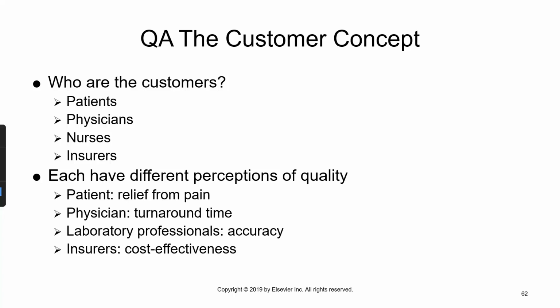Nurses. The nurses are the ones that usually collect the specimens and send them down to the hospital lab, and then the hospital lab will evaluate the specimen and make sure that it's appropriate. If it was collected on the wrong swab or in the wrong transport container, or if the wrong test was ordered, that's something we would report back to the nurses and say, hey, this isn't okay. But on the opposite side of things, if a nurse collects it correctly and sends it down to the lab and we make a mistake and we drop it or misplace it or open it up and contaminate it, then we have to call the nurses for a recollect. And that's not always well received by the nursing staff.